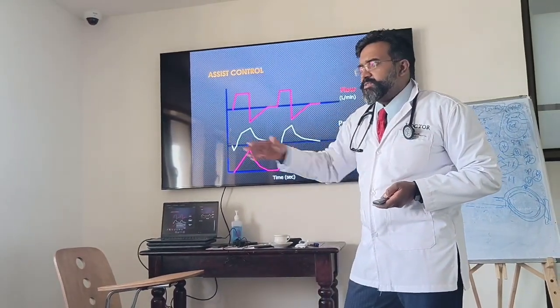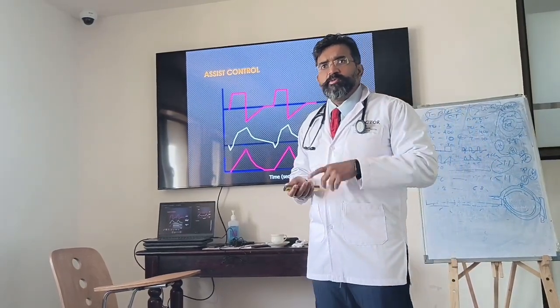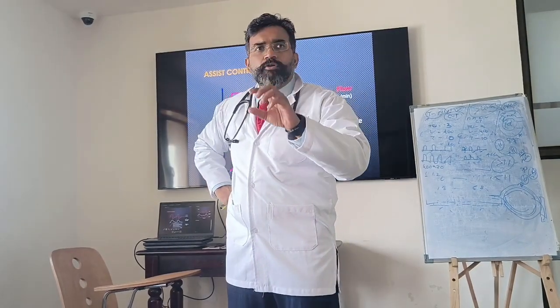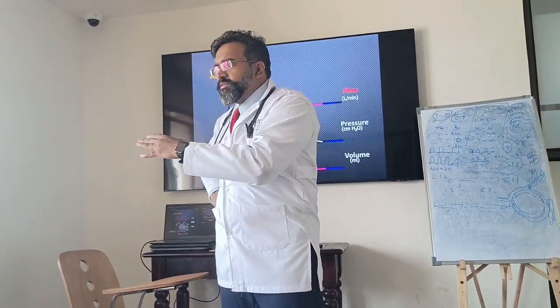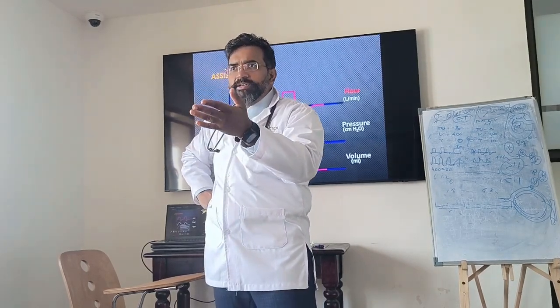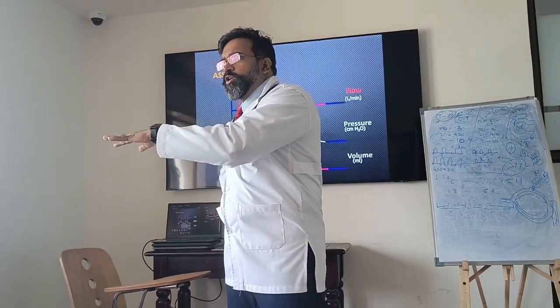Probably you need higher breaths. Probably not set the right tidal volume. You understand? There can be so many problems. Maybe he has small tidal volumes, so he requires higher minute ventilation, and so he's breathing faster to get that higher minute ventilation. With that breathing faster, what is happening? There is more opening, closing, more biotrauma, more atelectrauma.